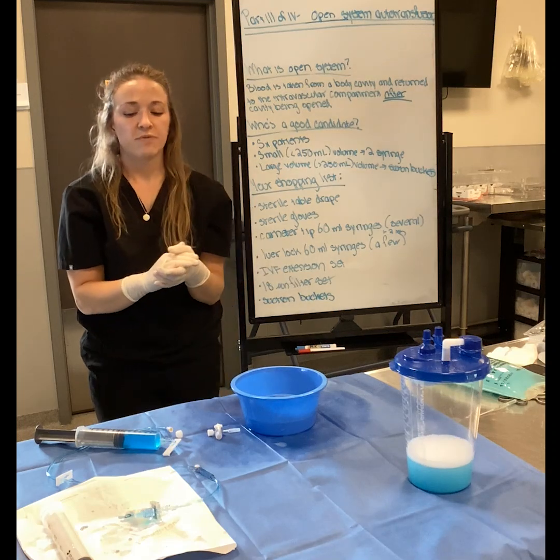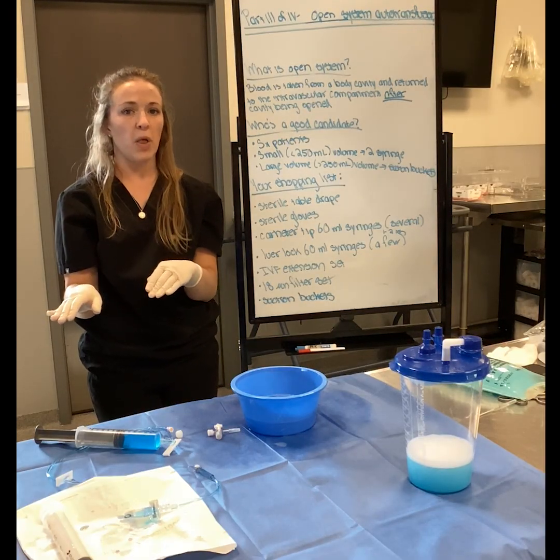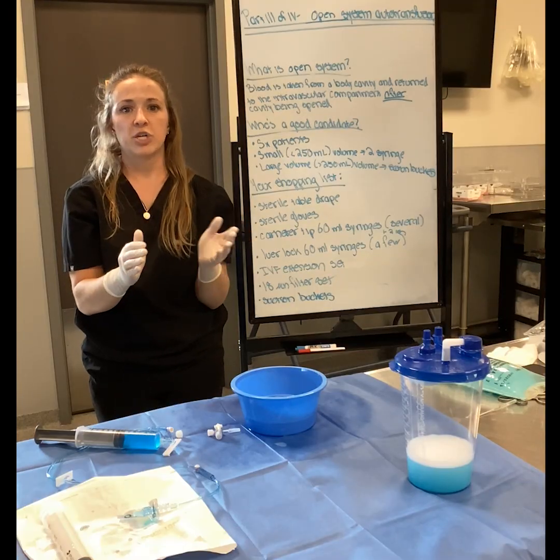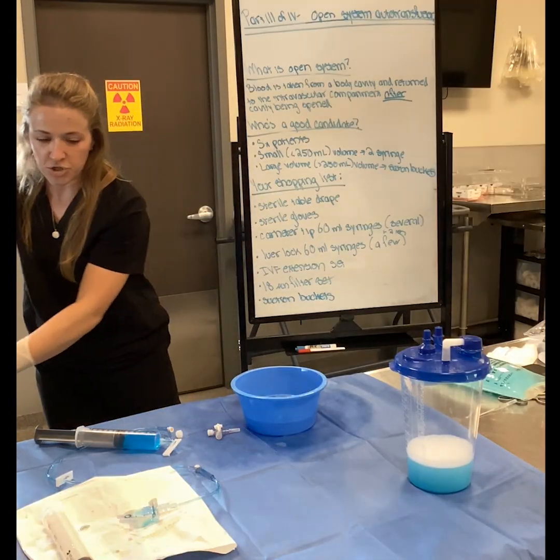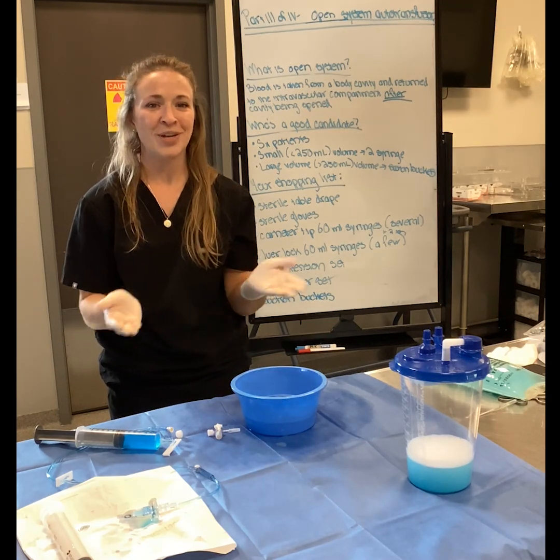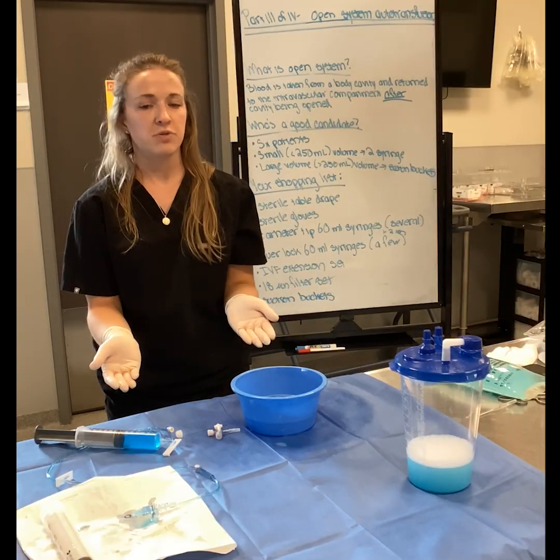Now, one of the disadvantages of this particular system is that it can be a little more tricky to apply anticoagulant. Generally speaking, for every 1 liter of blood that you are providing, you should be giving around 140 mils of citrated anticoagulant solution. It's just based on the ratio that is provided in some of our most common blood storage bags. So I certainly recommend the use of it. You can always calculate that ratio and give that to the patient. And again, the community's kind of split still on, do we do it or do we not? My thought process is that if you are unsure if there's active bleeding, and it's really hard to find out, I would recommend the use of anticoagulant.